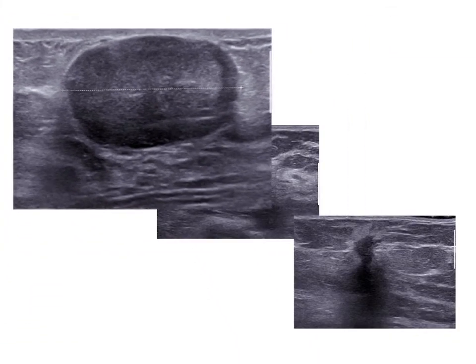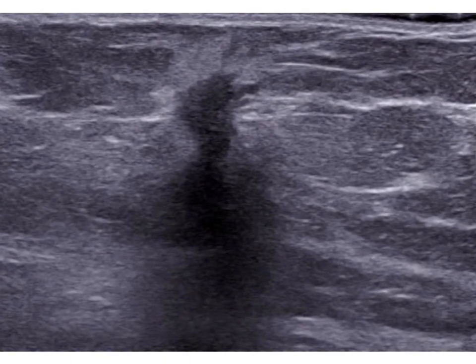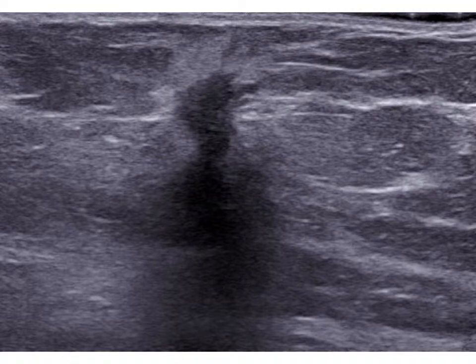Now, look at the tumor on the right. This is an invasive ductal cancer, the usual type of breast cancer that is found in women who do not have an elevated risk. This looks very different from the fibroadenoma that we saw before. There is no capsule, but instead you can see a pattern of black radial lines extending out from the tumor like a star. This type of stellate pattern is easy to see on mammogram.